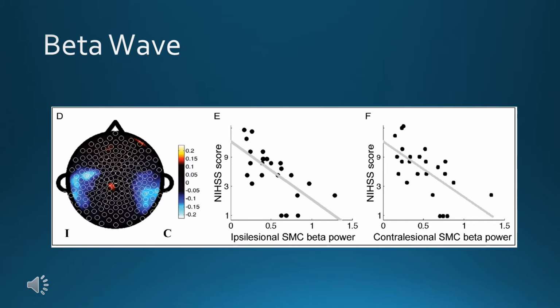This makes sense because beta waves are typically produced when an adult is awake, so having these produced would indicate non-injury. This is opposite from the last one because it was positive correlation, because delta waves are not typically produced when an adult is awake, so having those produced when they are awake would indicate injury.